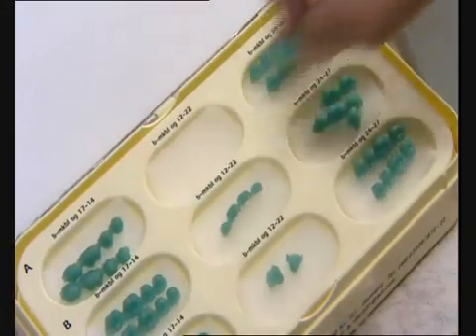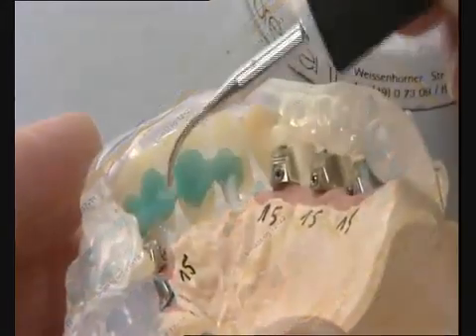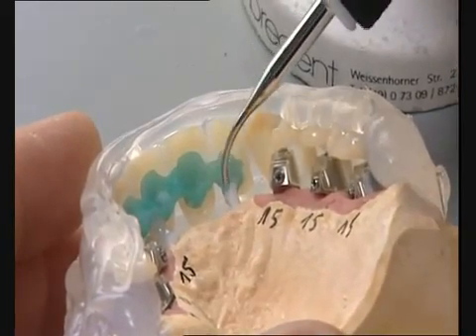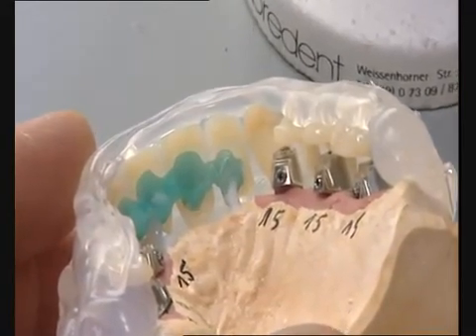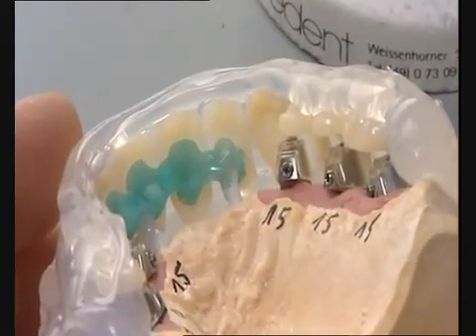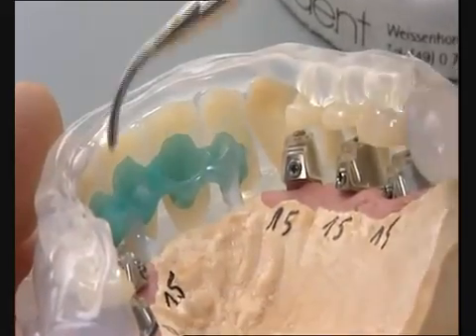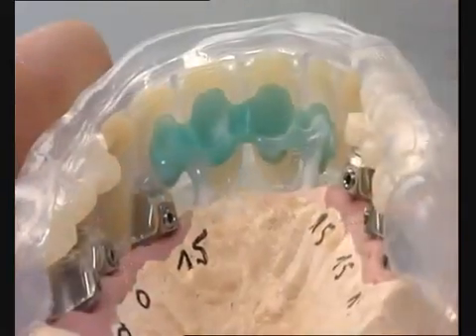Using pre-formed wax aids greatly facilitate waxing up the framework. The framework pattern follows the palatinal contour of the veneers. When waxing up the framework, a gap of approximately 0.3 mm should be allowed for the opaque and adhesive gap for bonding the veneers.